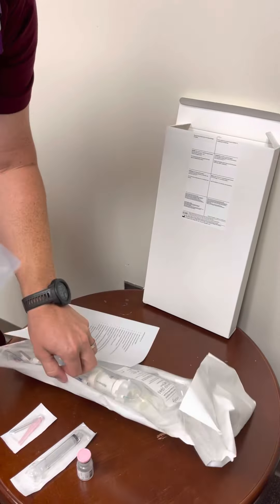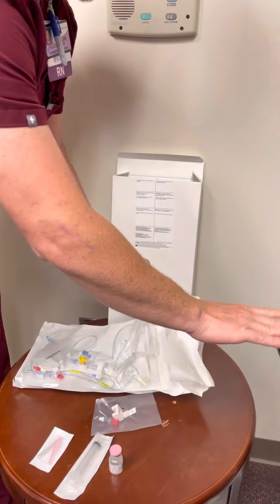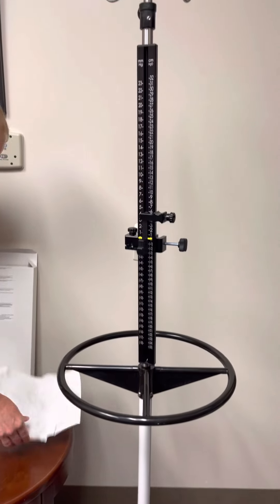We'll go ahead and take out our lumbar drain. Other equipment needed: a straight pole or IV pole.